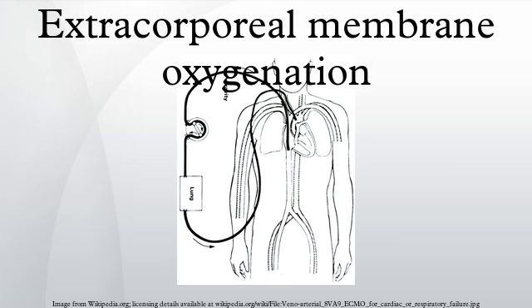Veno-venous ECMO liberation trial: VV-ECMO trials are performed by eliminating all countercurrent sweep gas through the oxygenator. Extracorporeal blood flow remains constant, but gas transfer does not occur. Patients are observed for several hours, during which the ventilator settings that are necessary to maintain adequate oxygenation and ventilation off of ECMO are determined as indicated by arterial and venous blood gas results.